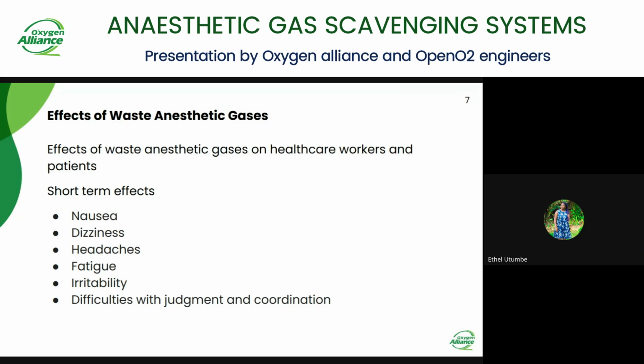Like I've already said, there are many effects that can come from these waste anesthetic gases. These effects can affect the healthcare workers that are working in the OR or the recovery room. There are short-term effects and long-term effects. On the short-term effects, some can experience a headache, some can have difficulties in judgment and coordination, and some can feel nauseous. So these are the short-term effects.